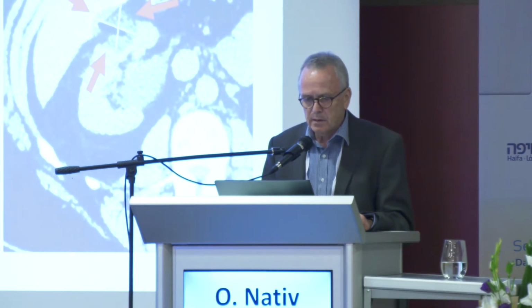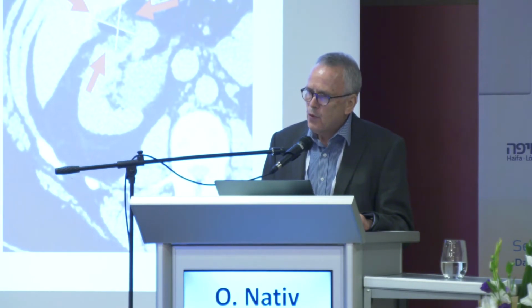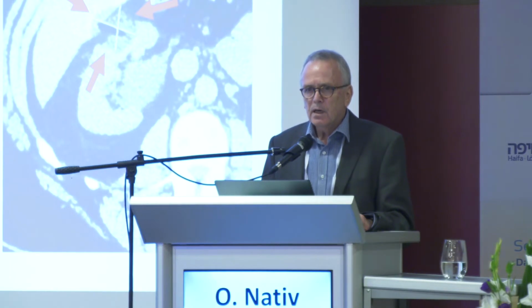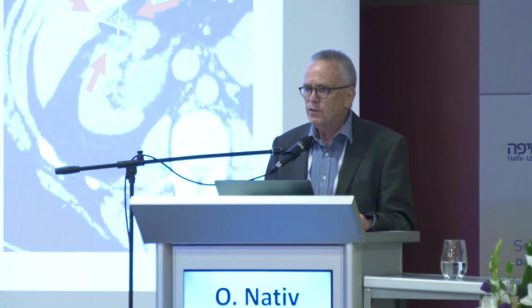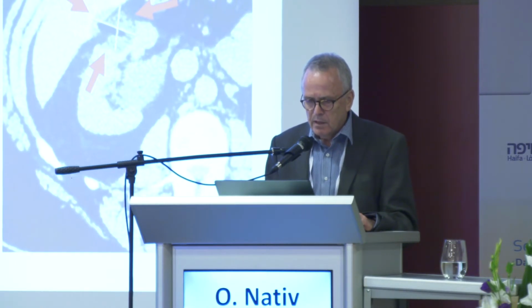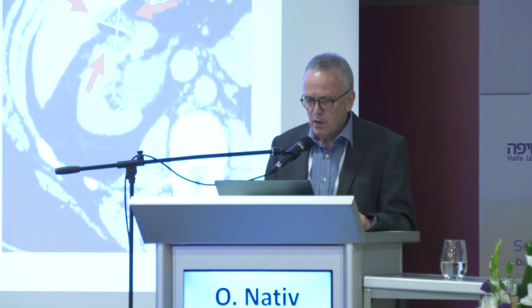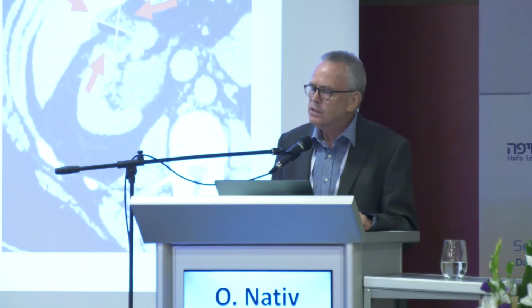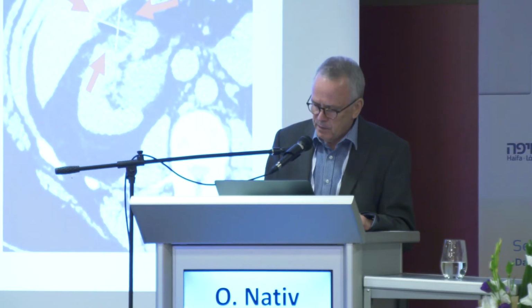Unlike in the past, look at the left side, you see the renal mass approaching the liver. But Robert, our interventional radiologist, is not afraid of the liver. You see in the middle, the probe is crossing the liver, and this is the freezing. On the right, you can see the ice ball demonstrating that this was a perfect procedure.